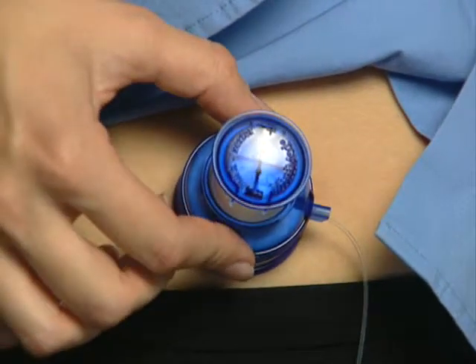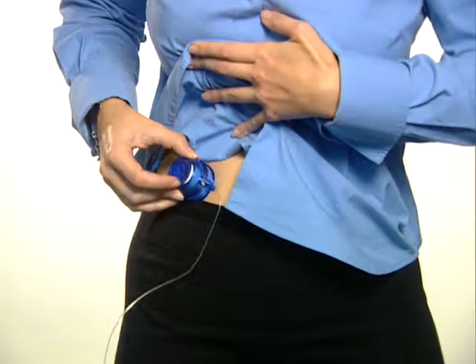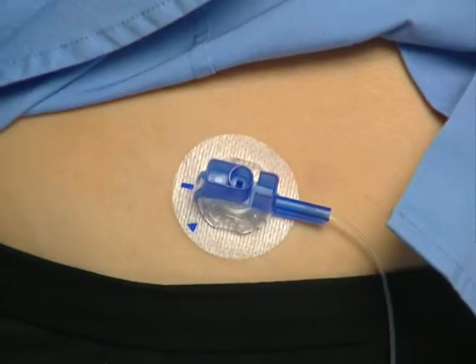Simultaneously squeeze the two white buttons of the Kwikserter device to insert the Kwikset. Press down the release button on the serter with your index finger to release it and then lift it away.